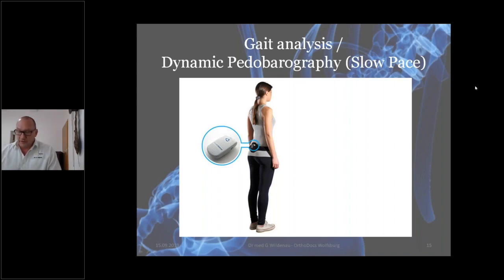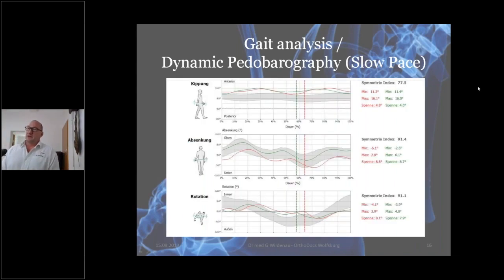We do go to the treadmill and let patients walk at two speeds, slow speed and maybe slow-pace running, to simulate two different gait patterns and to simulate different weight bearing onto the pelvis. And what we see, this is a patient that has been cleared by all our static analytic tools, and now we think he's fine, and we go over to start our dynamic procedures.